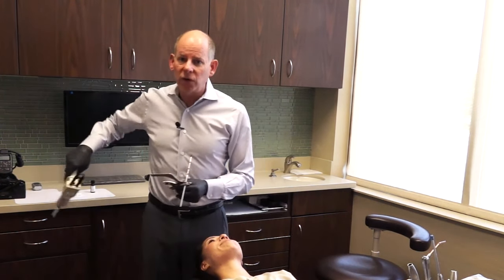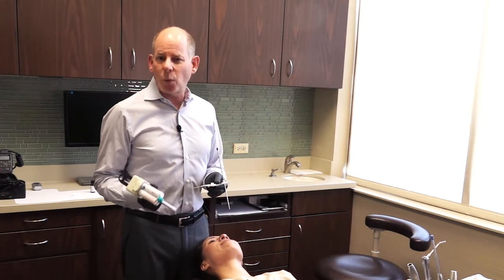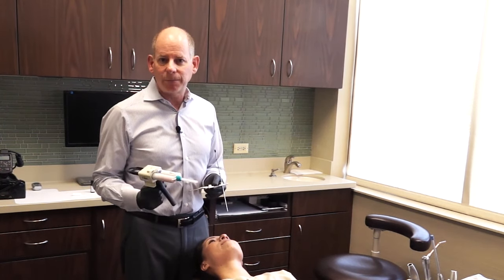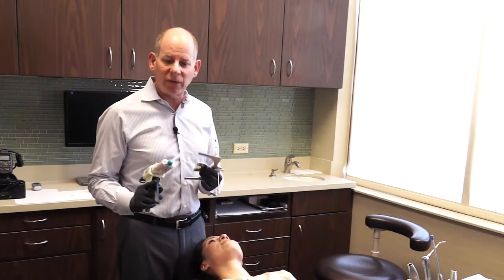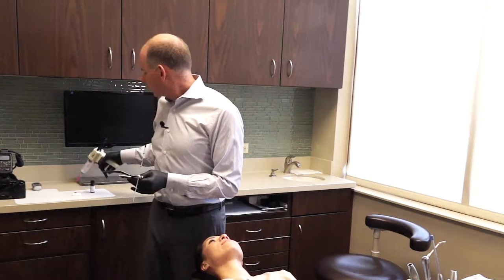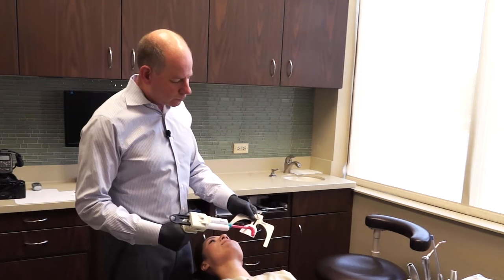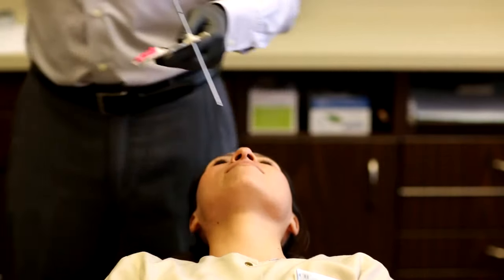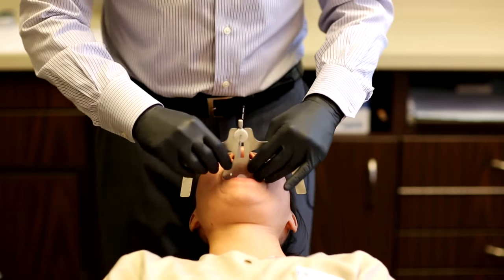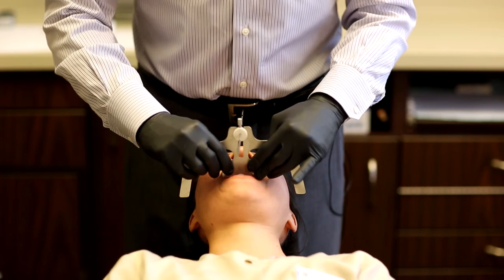For registration I'm using Futar D from Kettenbach as my bite registration material. I like Futar D a lot — it flows well, hardens to a good firmness that makes trimming easy, and has about a one-minute set. I make sure the material is bleeding evenly before putting on the tip and squirt a little out before applying it to the plate. I apply an even layer of material across the arch, bring it right to the mouth, center it, verify it's parallel to the face and perpendicular to the floor, then hold it for one minute.